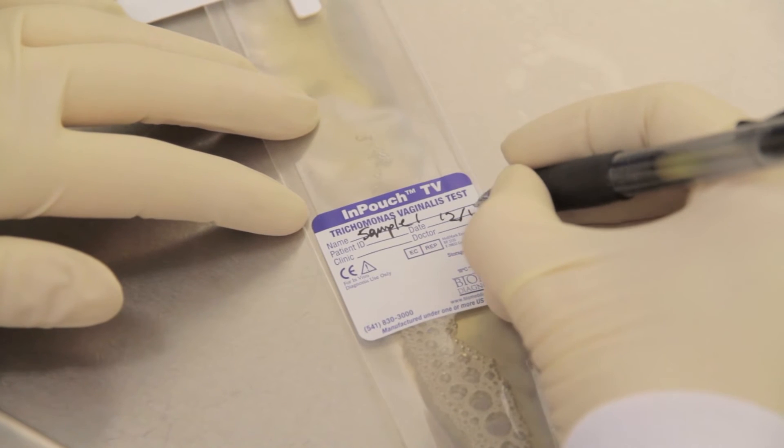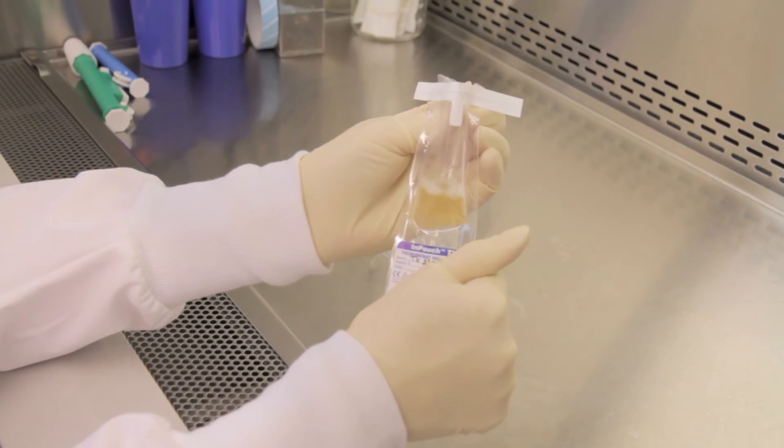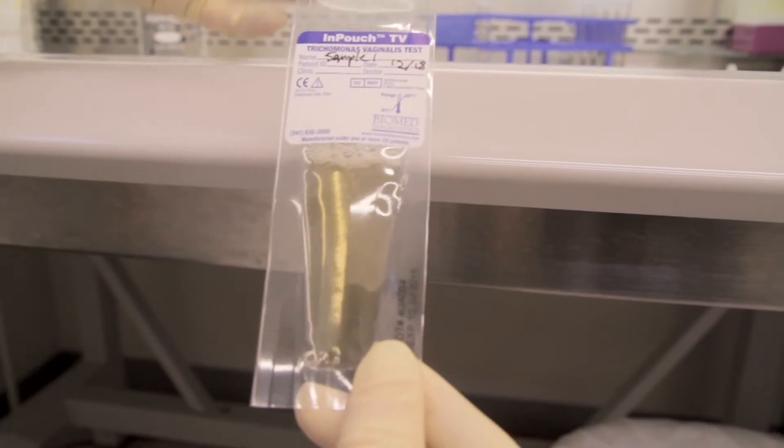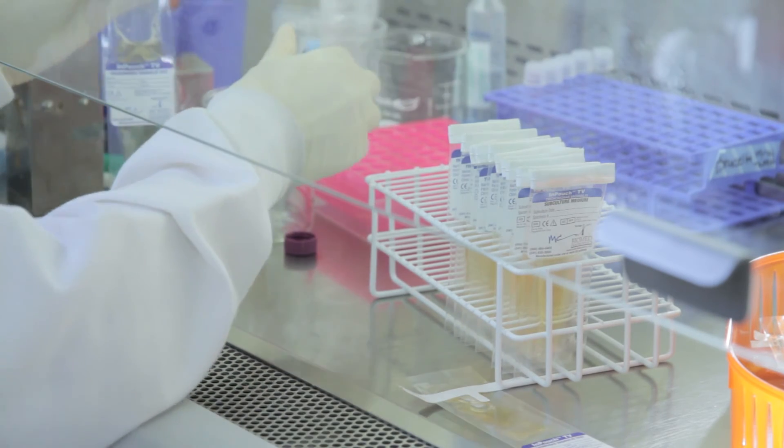At first look, you see the InPouch TV device is divided into two chambers. The upper chamber is designed for inoculation, the lower chamber for incubation. This self-contained design makes it ideal for off-site sampling or for point-of-care testing.